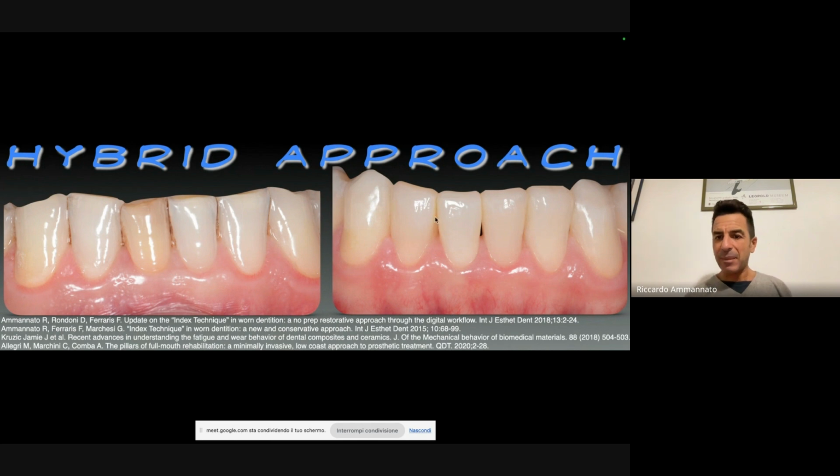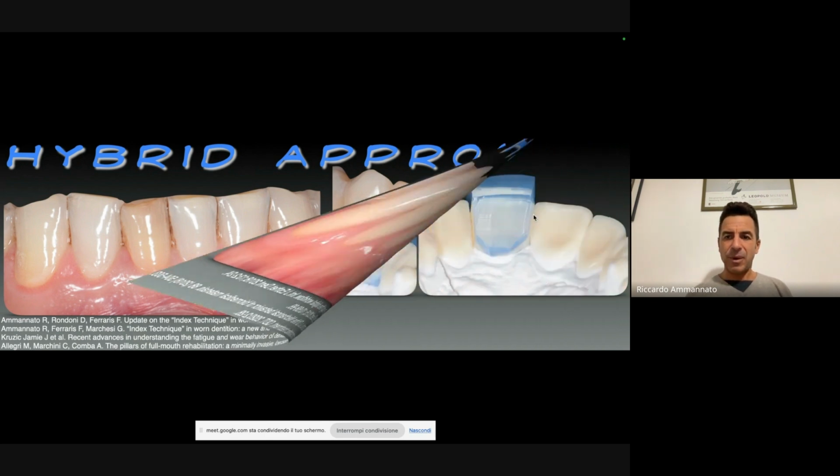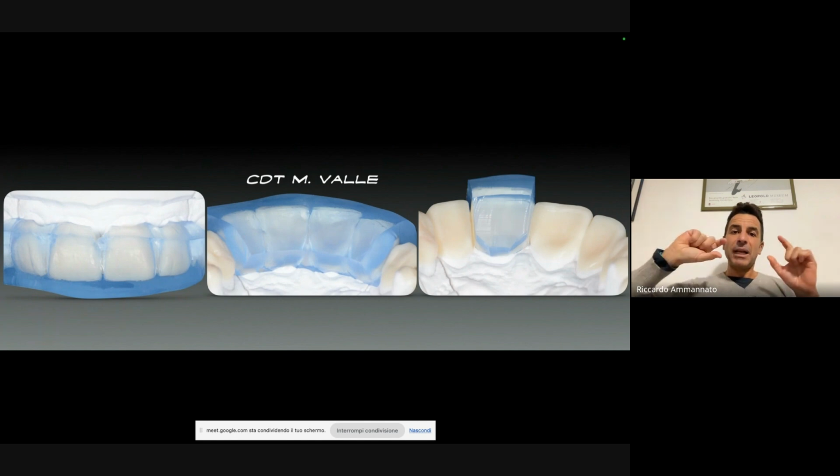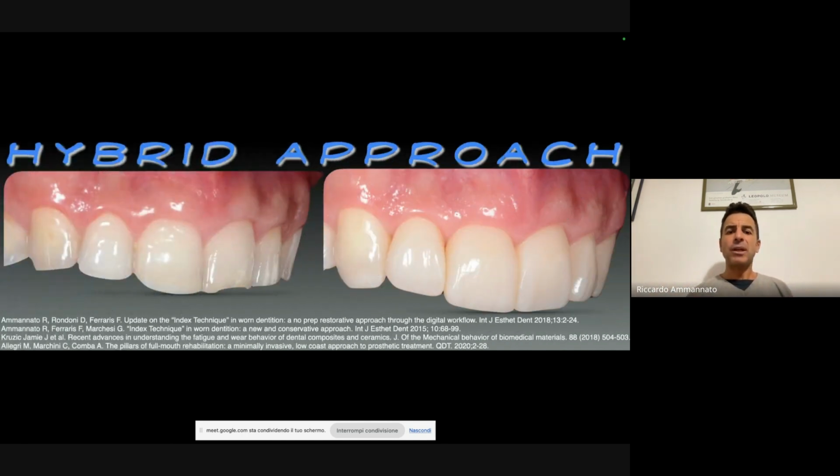And so from lateral to lateral, we have the molding approach through the index technique, while we have the canines with the glass ceramic. On the upper, same kind of material, also in occlusion, we will have the incisors in antagonist, composite against composite, while on the canines it is going to be glass ceramic against glass ceramic. And so here, this is before, after. Obviously, I have all the steps. I have also many videos on this procedure, but I'm skipping all this due to the fact that we don't have that much time. And this is before, after on the upper.